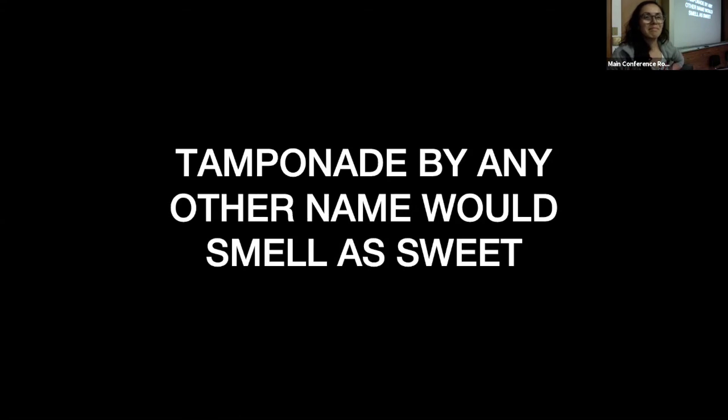Maybe. Certainly, the couple I've done in the arrest situation were ones where you went to the introducer for a central line, because that one's about 5 or 6 centimeters, so that had enough depth to get there. You shift over to the parasternal approach, you only need 2 or 3 centimeters, unless you work out heavily and have to get through all that pectoralis muscle. You probably need just a few centimeters to get to that same space. So all of a sudden that 18 gauge that you have in every single cart is feasible to get to that fluid, and you don't need a specialty needle to achieve that.